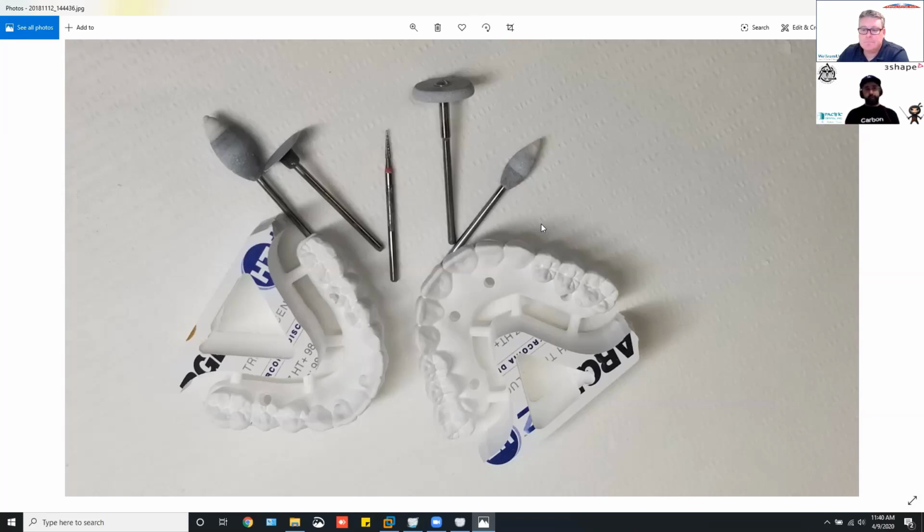I was getting thousands and thousands of units of burr, and I was like, wow, a $159 tool actually lasted me almost two months. To me that's worth it. But then you have the other side, like, well, the finisher's taking longer, and he's using greenstones or burrs, and they're running through that more, and it's taking longer there. So it's a fine, delicate balance.